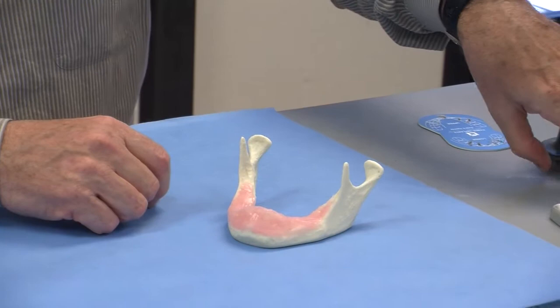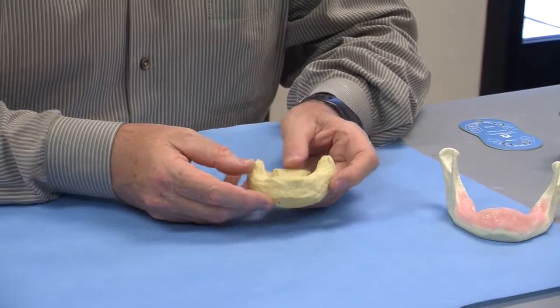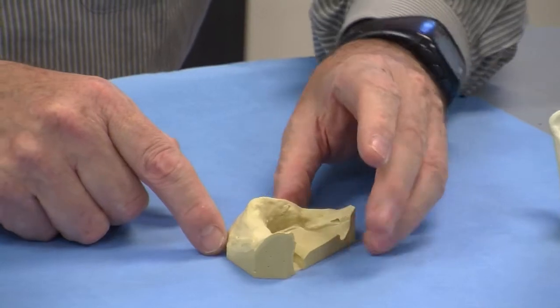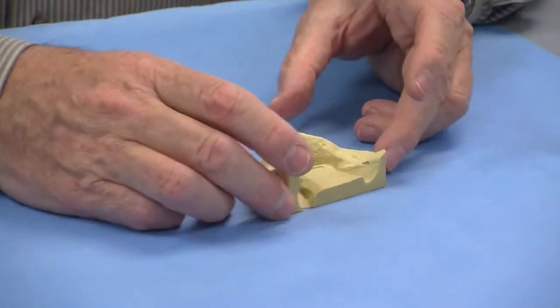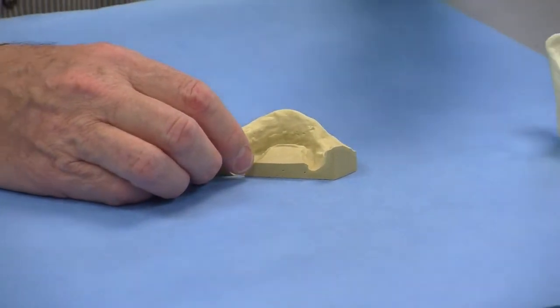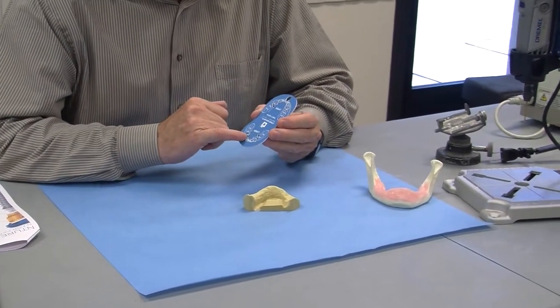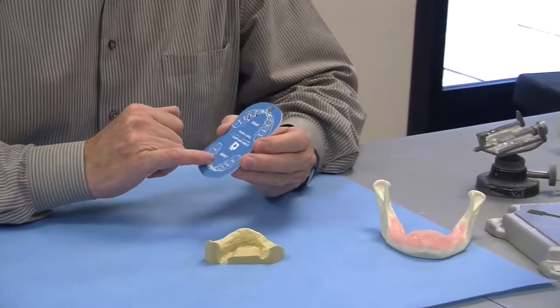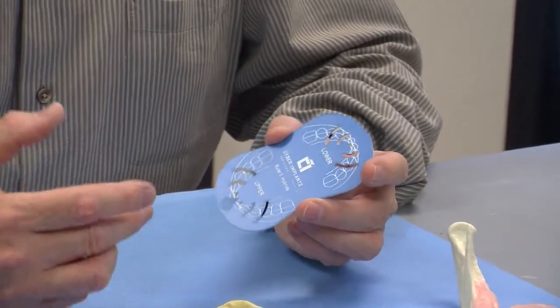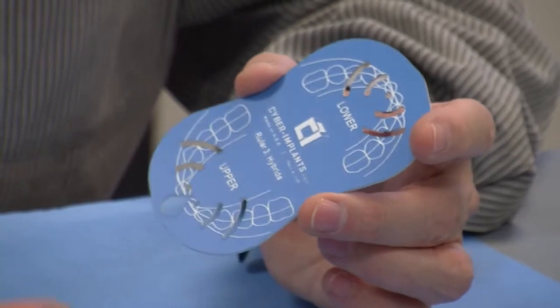After impression with alginate, we can reproduce the patient into a cast plaster model. In order to place the implant ideally well, we use a Cyber Implant ruler, which is designed to space the locators ideally. This ruler is designed for regular size implants, but the problem with locator implants is to have enough spacing for the attachment of the locators.